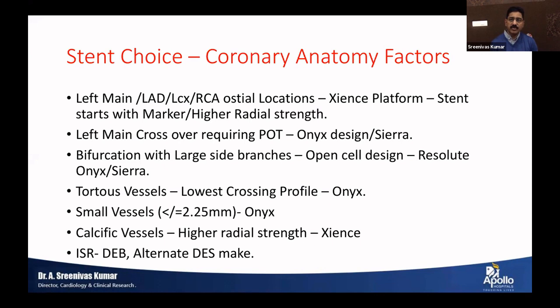with a cutting balloon, depending upon the type of cause for the restenosis you decide. If stent under-expansion is the problem, you expand it well with the cutting balloon and treat it. But if in spite of all that it's diffuse atherosclerosis, probably you can use alternate stents. If it's restenosis, this was more relevant in paclitaxel versus limus, but now at least with one drug type of stent restenosis, we tend to select the other.